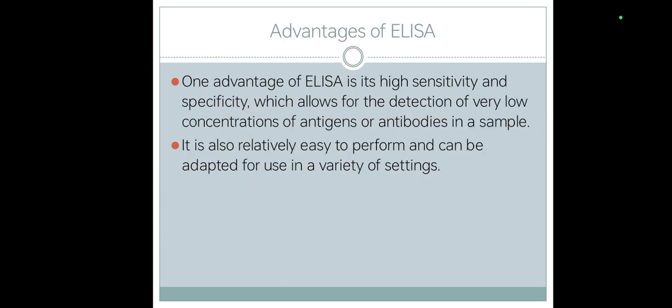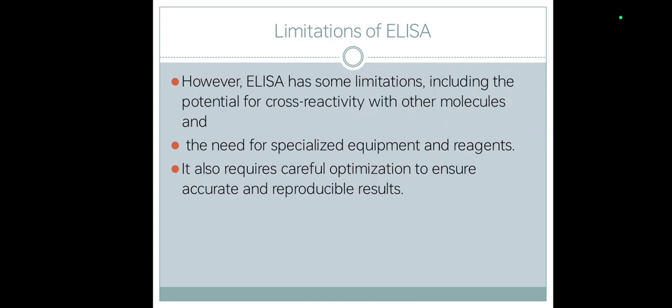Advantages of ELISA. One advantage of ELISA is its high sensitivity and specificity, which allows for the detection of very low concentrations of antigens or antibodies in a sample. It is also relatively easy to perform and can be adapted for use in a variety of settings.